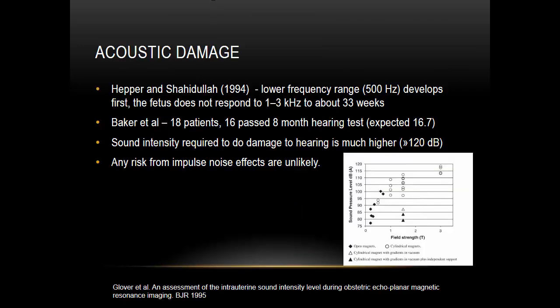because you have all of these factors to consider. In 1994, this particular study looked at the effect of acoustic damage, and they had 18 patients in the study by Baker. They found that 16 passed the 8-month hearing test.